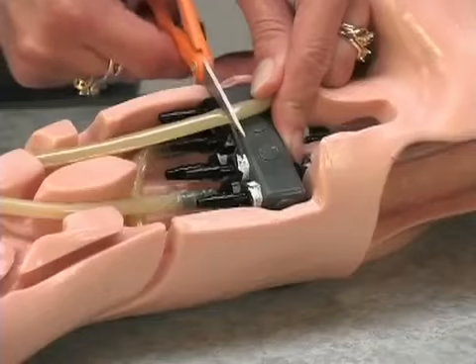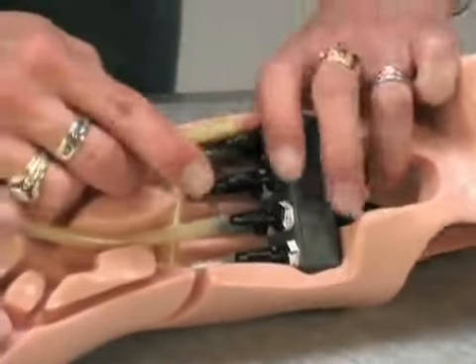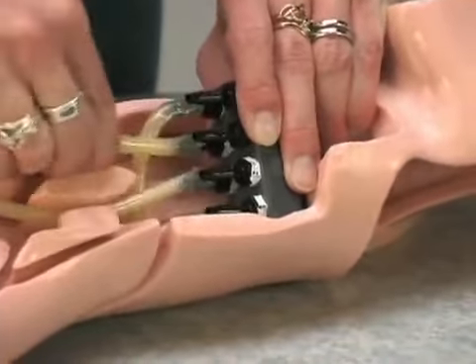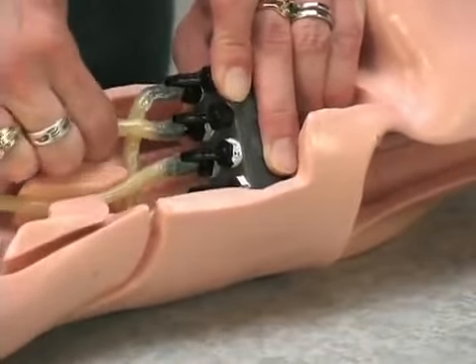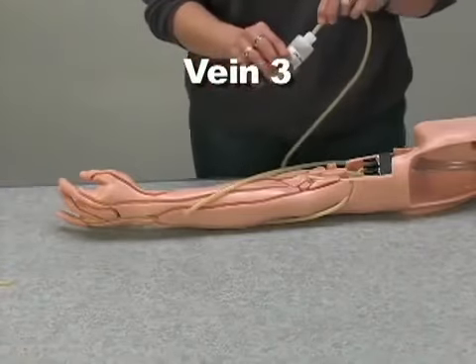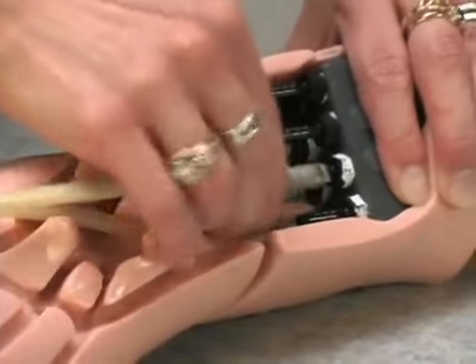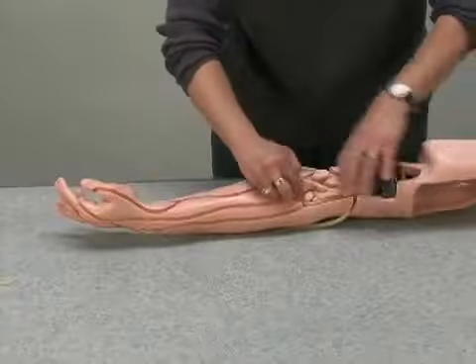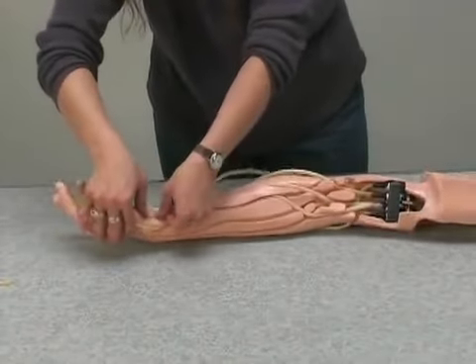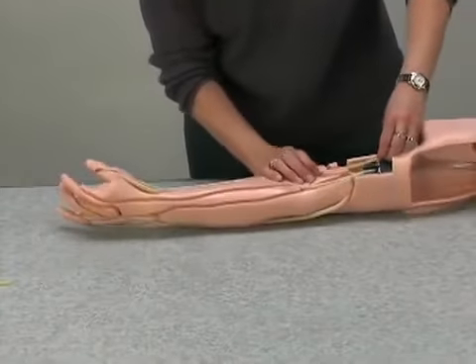Cut the end of the vein to fit. Lubricate and connect to fitting number 3. Take the third replacement vein, lubricate, and connect to fitting number 7. Work it into the channel down the forearm, around the palm side of the thumb, and back toward the connector block in the same channel. Pass the vein over the first section of tubing and the second section.